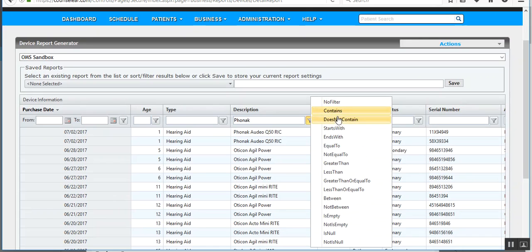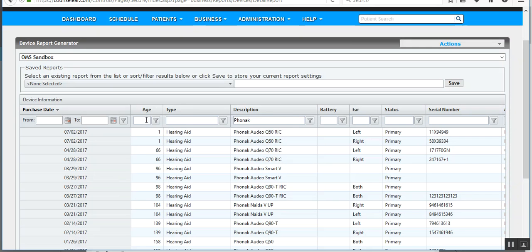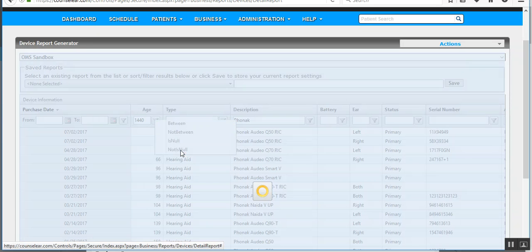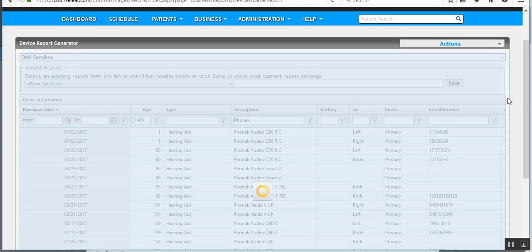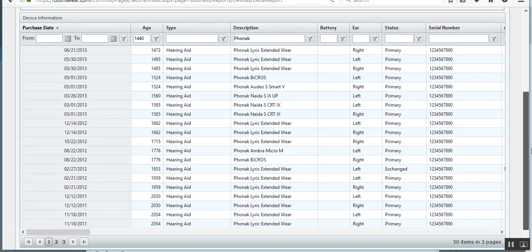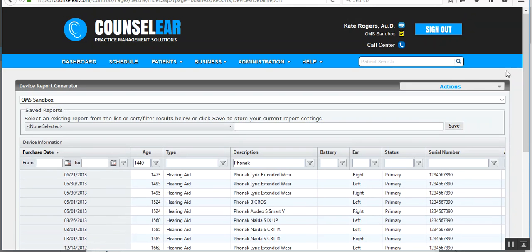I can filter by that. And maybe I want to look at devices that are over a certain age. So I'll just make up a number here, approximately four years. And I'll say greater than. So that leaves me with 50.